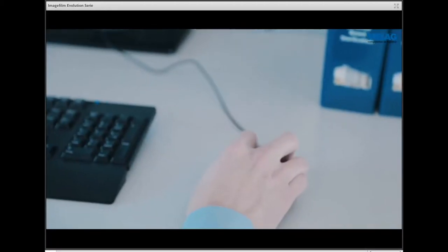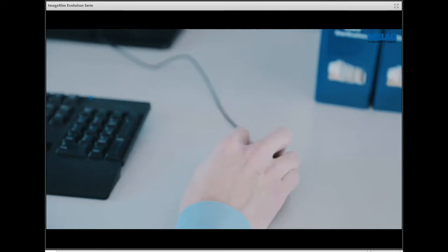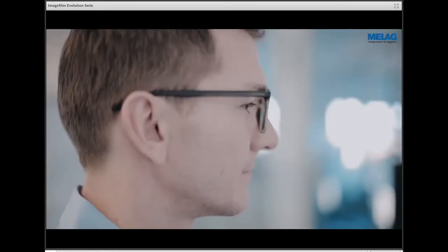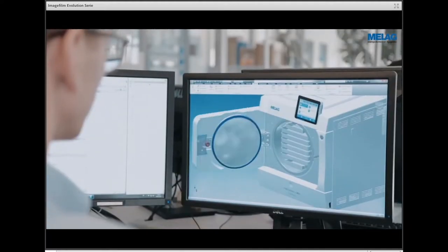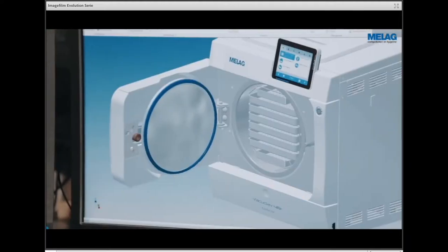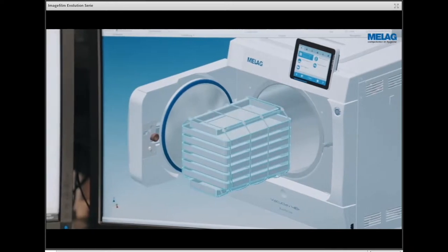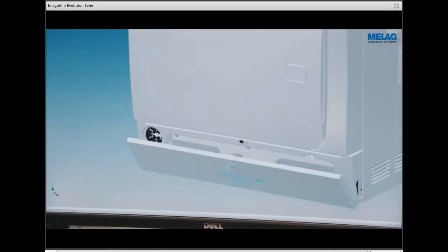The team was immediately enthused by the idea of the new MELAG Evolution Series. The new device combines energy efficiency, shorter operating times, and improved user friendliness. The new series can accept an amazing eight loaded trays, accommodating even more instruments than its predecessor, meaning fewer sterilization procedures, lower energy consumption, and cost savings.